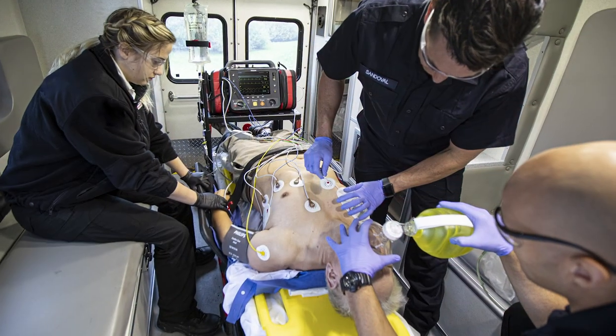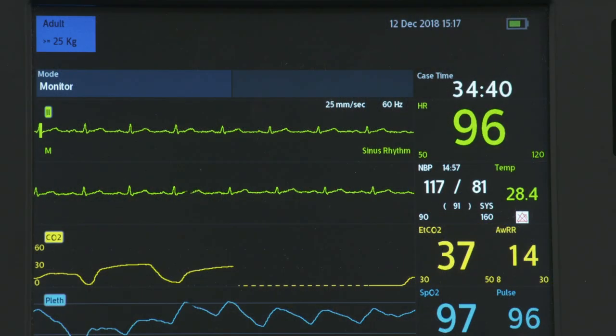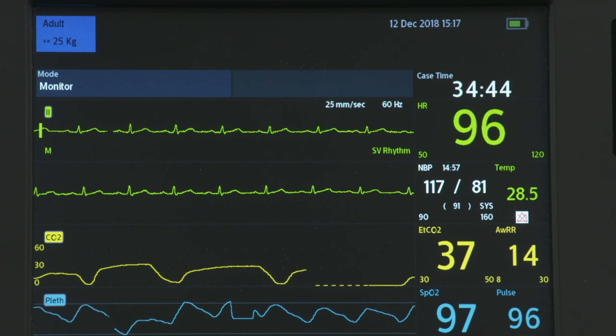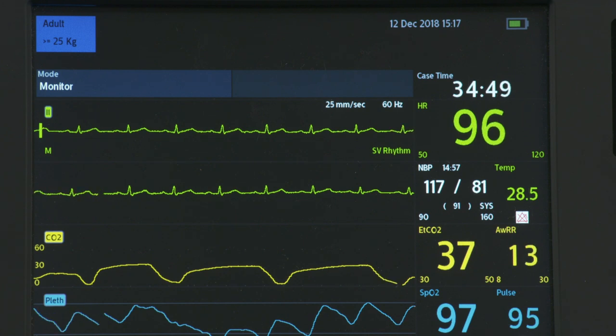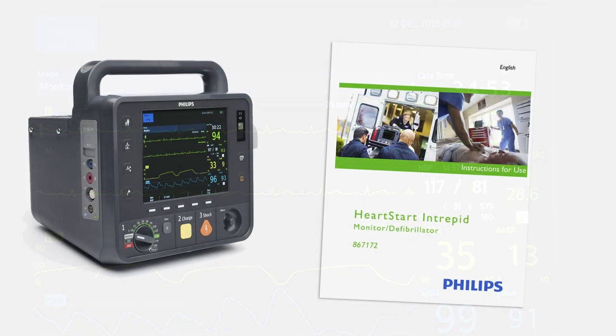No matter where you work, the HeartStart Intrepid can be configured to meet your clinical needs. For this program, we'll demonstrate operation using the default configuration settings. Be sure to familiarize yourself with your device's configuration before using the HeartStart Intrepid. Prior to using the HeartStart Intrepid, you should also review the accompanying documentation, such as the instructions for use, for additional information about its operation.